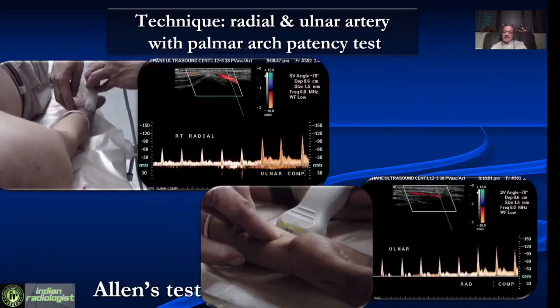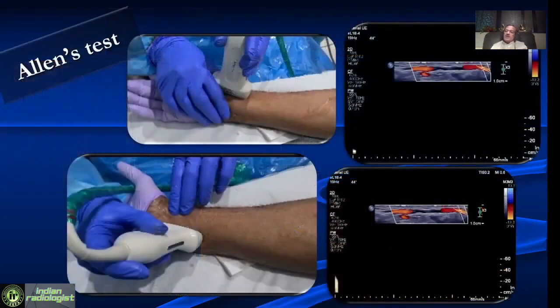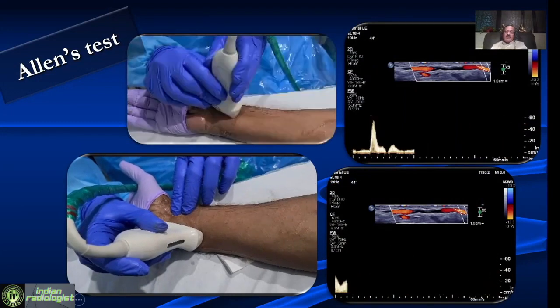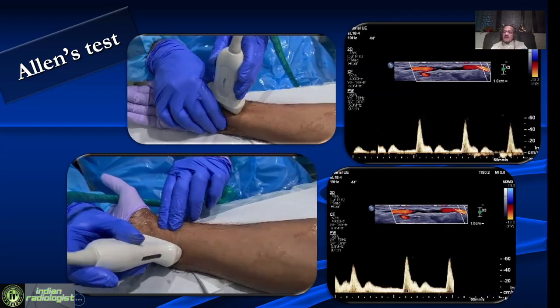There are some tests we need to do in the upper limb. One is the ulnar stress test, done to assess palmar arch patency before taking the radial artery for bypass surgery. We look at the radial artery, compress the ulnar, and look for an increase in velocity. Then we look at the ulnar, compress the radial, and again look for an increase in velocity. This increase in velocity should typically be at least 30 to 40 centimeters per second. This is the Allen's test.